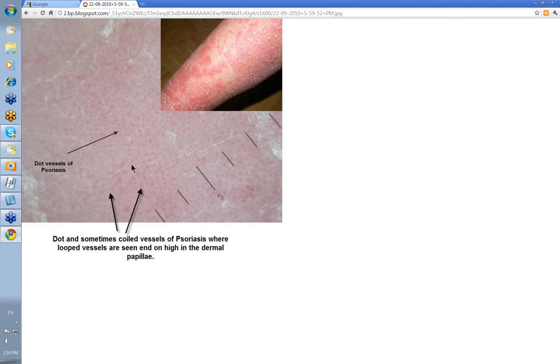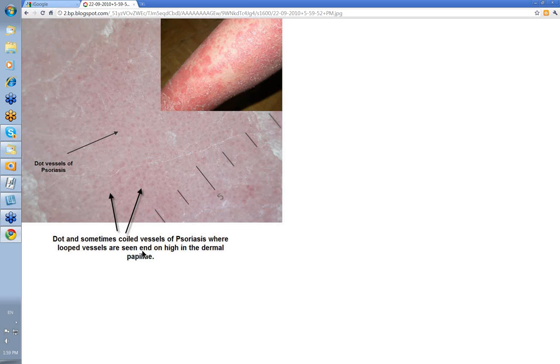Dot vessels, though, could be inflammatory skin disease. These are the dot vessels of psoriasis. Remember in psoriasis, if you know your histology, you've got a thickened epidermis and a large dermal papilla. As the vessels come up through those and are seen from above, they're seen as dots — loop vessels seen end-on high up in the dermal papilla, that's why they look like dots.